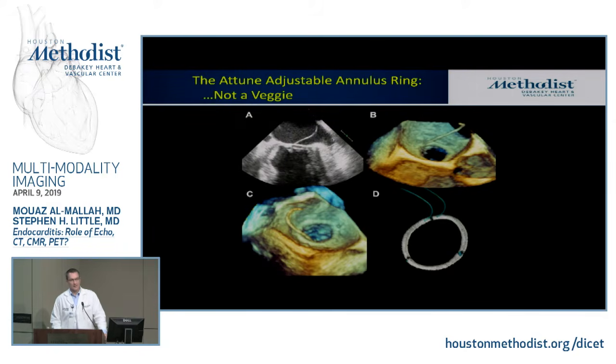So what this patient had was an adjustable surgical ring. So this is the ring in the box. Basically, the surgeon affixes it to the annulus and is supposed to use these two things to sort of tighten it up like a belt and really cinch down the annulus and throw several knots. Usually you get a little nubbin of about 10 knots deep, which looks usually at the 6 o'clock position on one of these valves on a 3D TE, this long little post of knots. In this case, the surgeon didn't tie that properly, and they sort of left this thing dangling. So it just took a little reassurance that nothing had to be done. So funky, but not endocarditis.